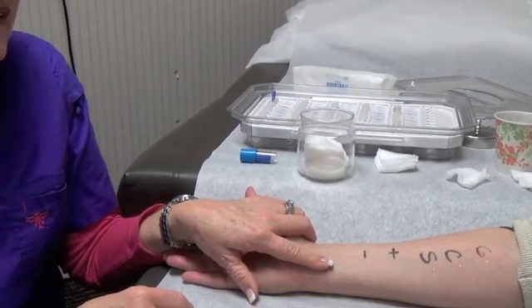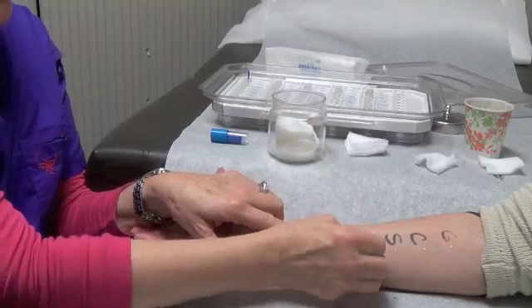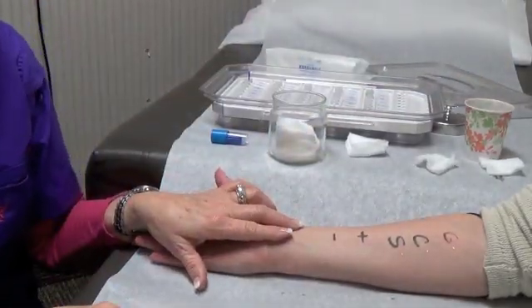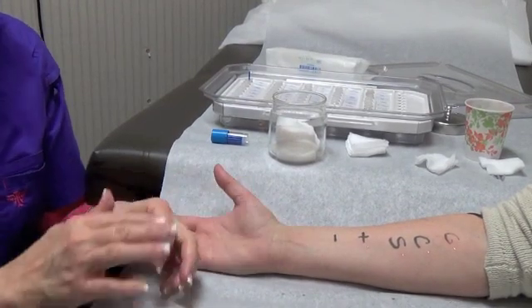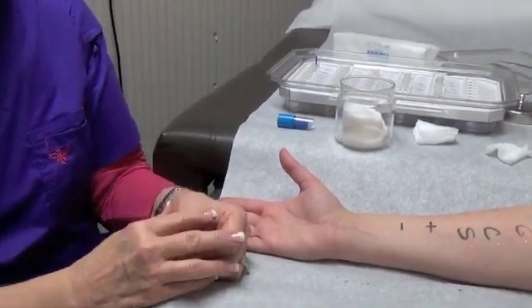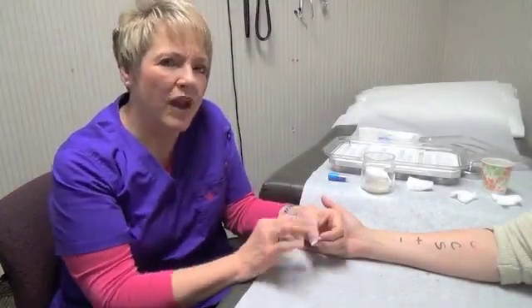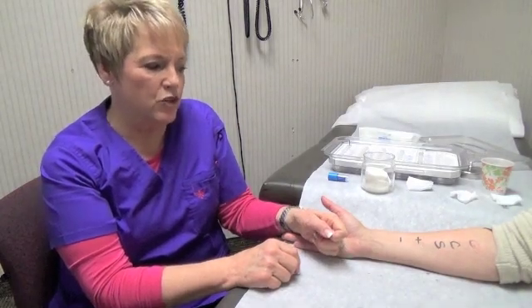This allows the skin cells to interact with the individual allergens. And if there is a sensitivity, it will initiate an immune response. The test stays on for fifteen to twenty minutes and at the end of that time we read the results. What we're looking for in an immune response is a raised wheal in the center — it resembles a mosquito bite — and it will be surrounded by an area of redness or erythema, and it will itch. The wheal and the size of the surrounding area of redness is directly related to the degree of sensitivity to that particular allergen.